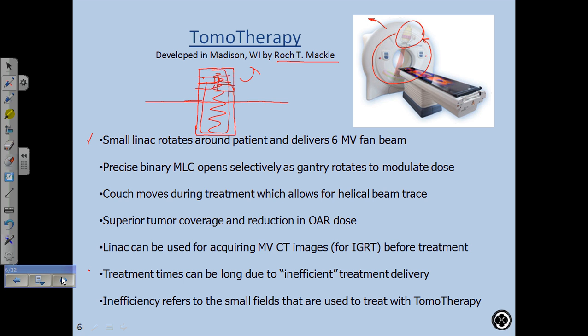So it takes about 30 minutes to treat a patient. Don, is that correct? That's how it was from last time. Have you been to Vallejo? Yeah, with the 2.5 centimeter slice thickness, the treatments are usually only about 10 minutes, but if they drop down to 1 centimeter slices, that can shoot them up to 20 plus. Yeah, and that talks to the efficiency. The smaller you get, the less dose you get per time, and the less efficient it is.